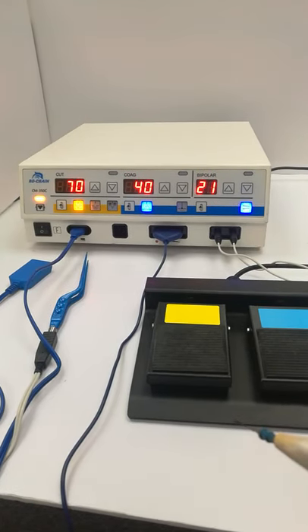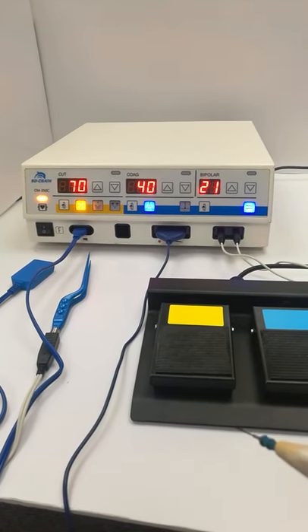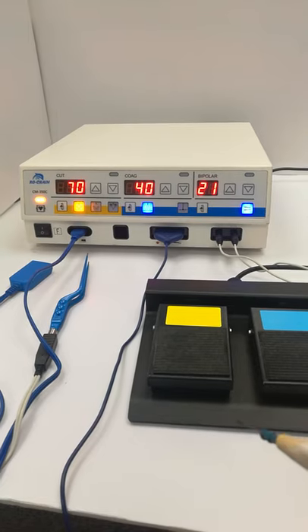Hi dear clients, this is Rauchan electric surgical unit generator, coterie.